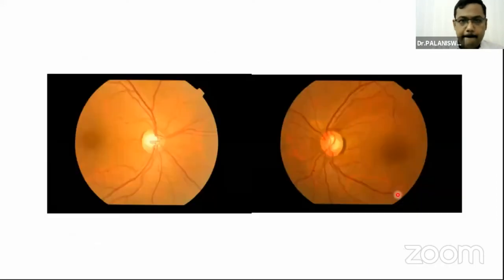So here the right eye disc looks normal. Left eye, we can make out there's a superior thinning with a retinal nerve fiber layer defect, which is again well appreciated over here.